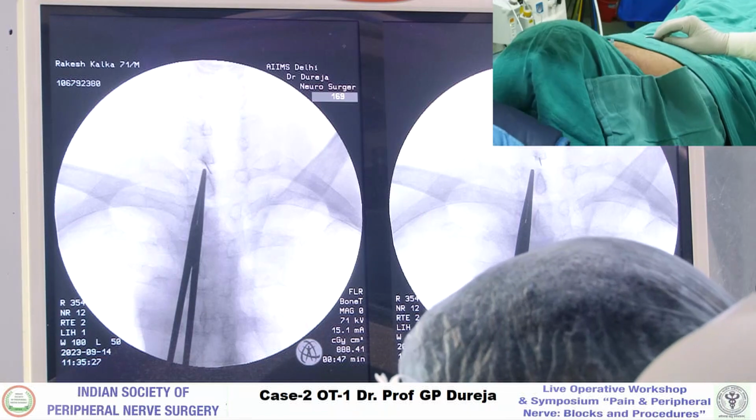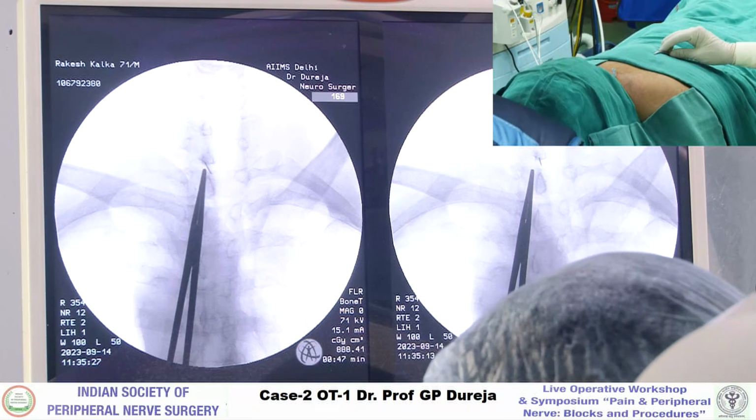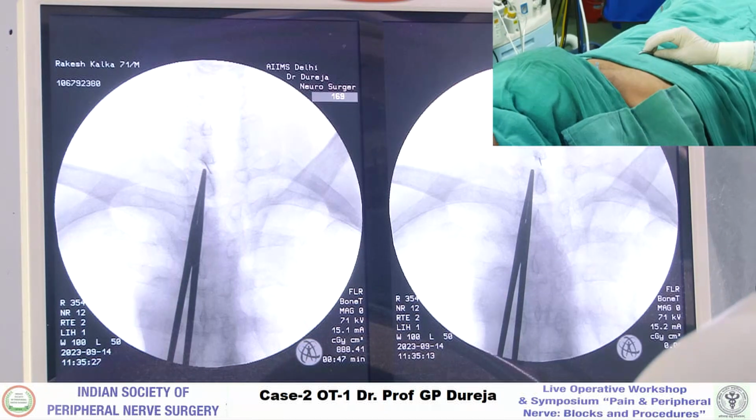So you're giving in the midline, sir? Yes, this is interlaminar, always interlaminar. So C7, T1.